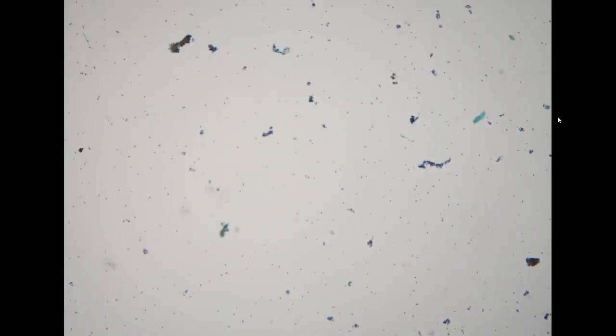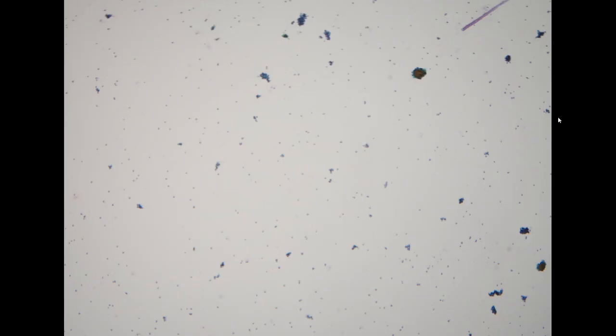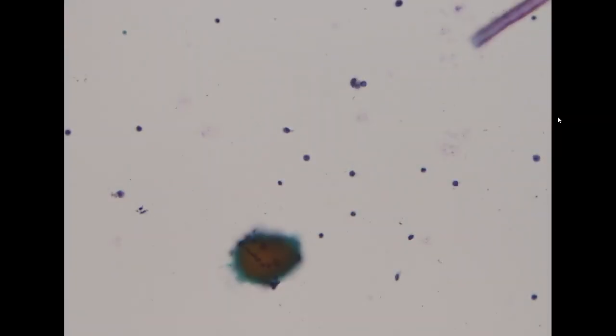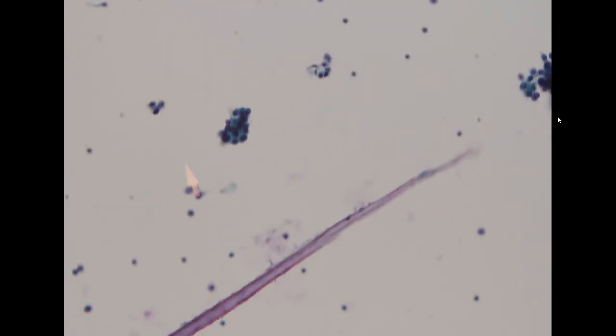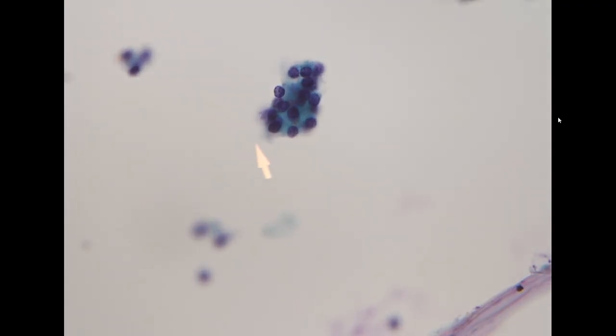So this is one of the cases. The second case has a very similar finding in that in the background we didn't see a lot of colloid, only a few thick colloid. In addition, we also see a lot of very tight, small cellular clusters composed of follicular cells with slightly enlarged nuclei, but without any features of papillary thyroid carcinoma.